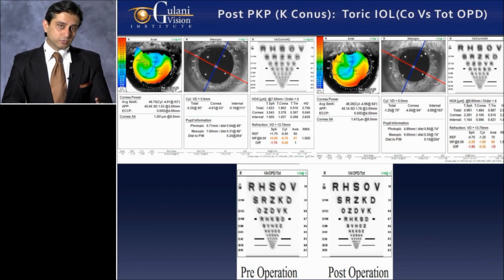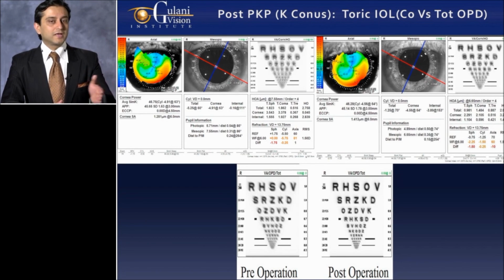So I would again like to reiterate, you're using the technology to first determine your plan of action, to determine did you execute correctly, meaning you're confirming it, and third, you're then looking at why exactly is this patient happy, and if not, what can you do to address it?